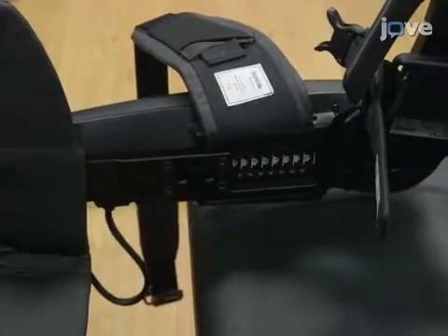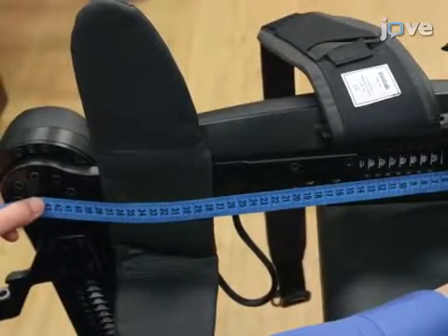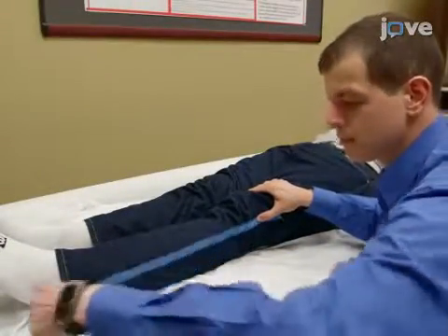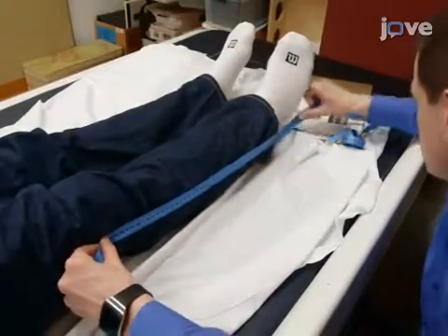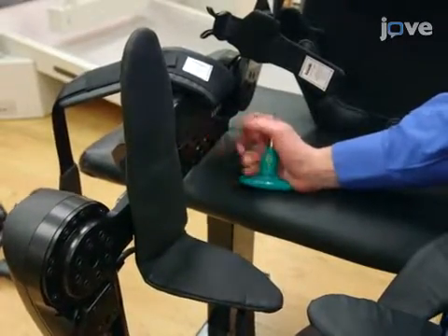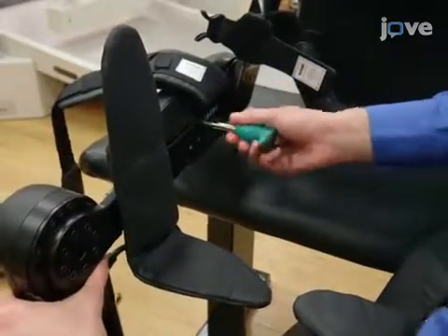Adjust the powered exoskeleton from the center of the hip axis to the center of the knee axis according to the distance measured on each of the participant's upper leg lengths. Next, measure the lower leg length from the knee joint line to the bottom of the foot. Repeat this measure for the other lower leg length. Adjust the length from the bottom of the foot plate to the center of the knee axis of the powered exoskeleton for each lower limb accordingly.